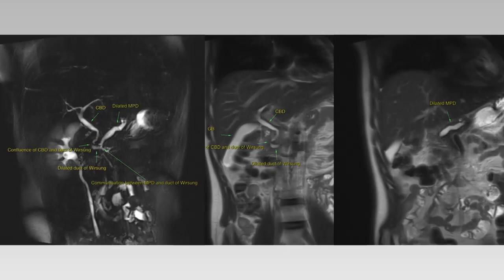To recapitulate: variant pancreatic ductal anatomy is seen with dilation of the duct of Wirsung joining the CBD and draining the ventral pancreas at the major papilla. The main pancreatic duct is dilated with dilation of side branches, possibly draining into the minor papilla via a thin channel representing the duct of Santorini. Communication is seen between the dilated main pancreatic duct and the duct of Wirsung. Overall, these findings are suggestive of incomplete pancreas divisum and are the likely cause of recurrent pancreatitis in this patient.